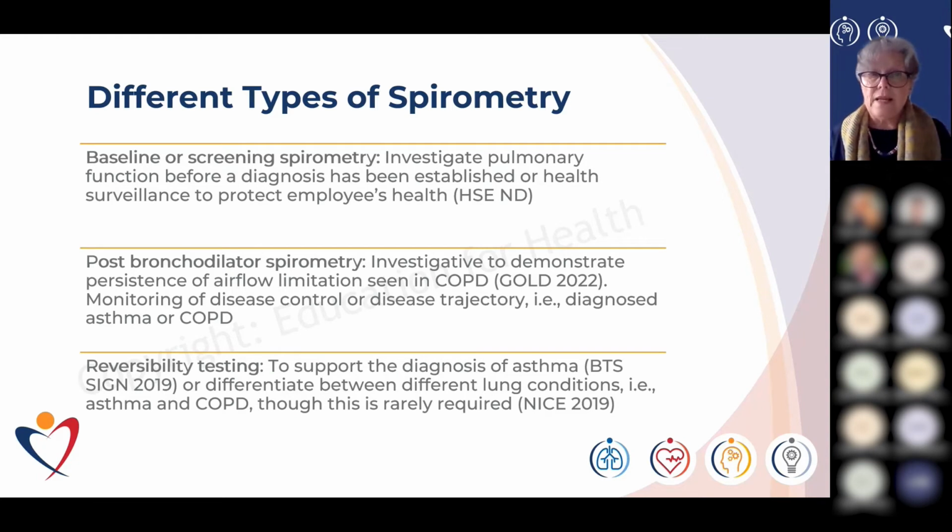We do post-bronchodilator spirometry, that's investigative to demonstrate persistence of airflow limitation, which is seen in COPD. And we use post-bronchodilator spirometry to monitor disease and that disease trajectory. And we use that in COPD and in diagnosed asthma.